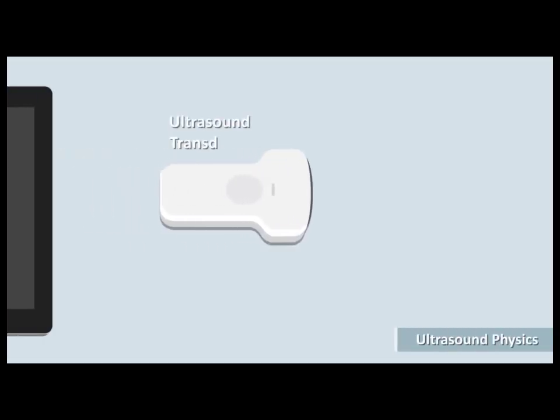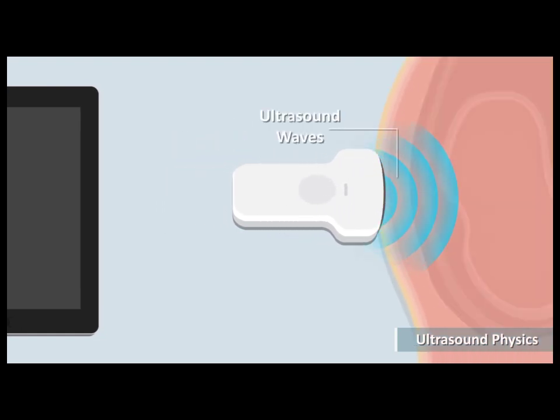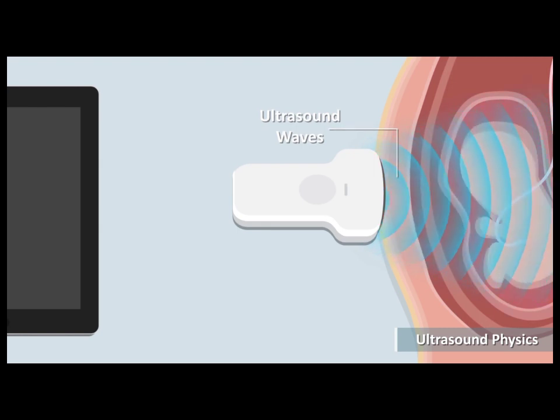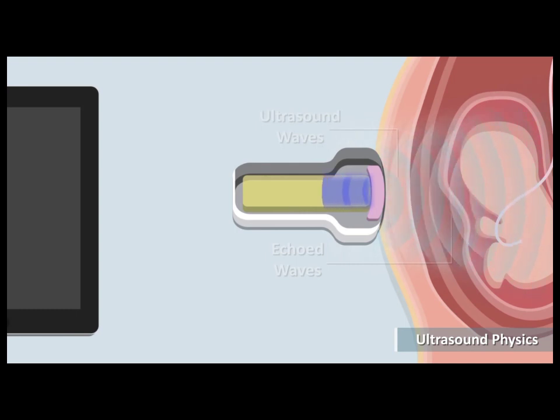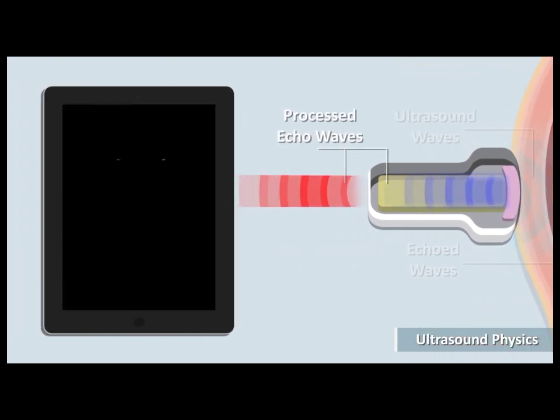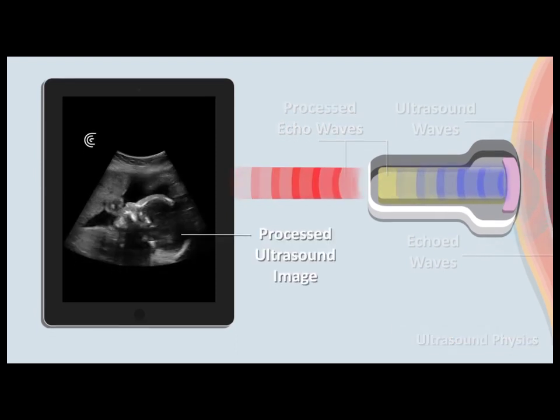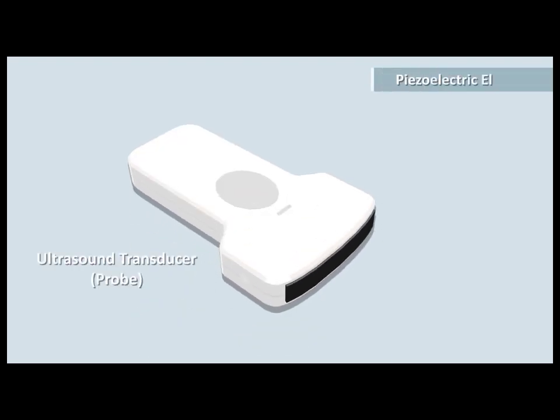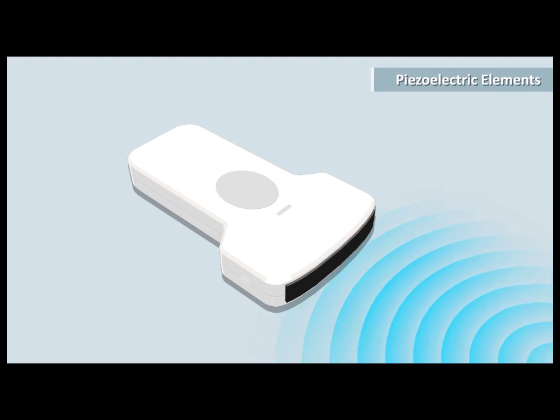Ultrasound imaging systems use a transducer, also called an ultrasound probe, to send sound waves into the patient's body. These sound waves bounce off different tissues within the body and return to the transducer. The returned sound waves, or echoes, are processed by an ultrasound engine to produce a black and white image of the organs. Ultrasound is a series of tiny mechanical pressure waves propagating through the body. These sound waves are generated, transmitted, and received by an ultrasound transducer.